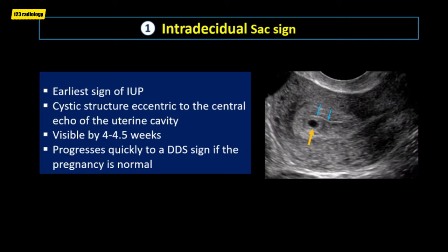The intradecidual sac sign represents the early gestational sac. It is visible by 4 to 4.5 weeks of gestation on transvaginal ultrasound. As you can see on this transvaginal image, the yellow arrow is pointing to the intradecidual sac sign, which is seen eccentric to the central echo.